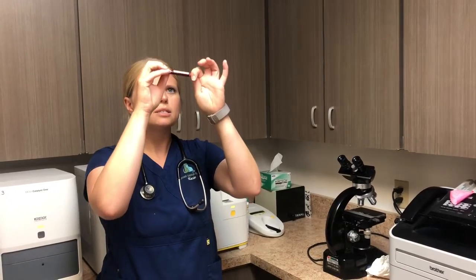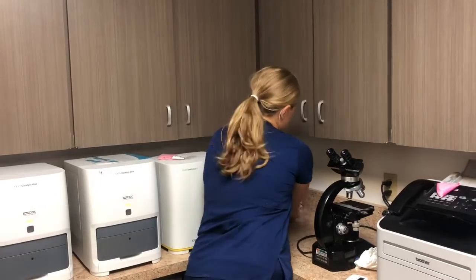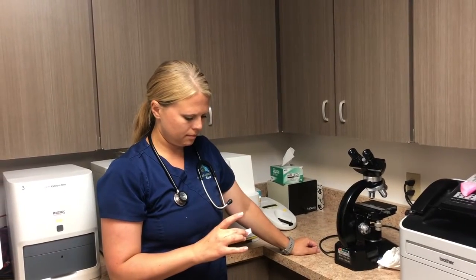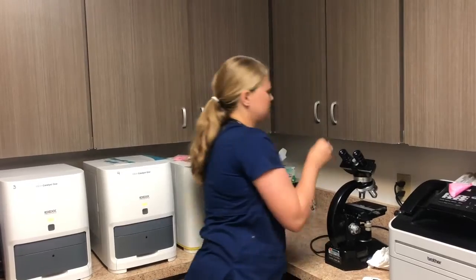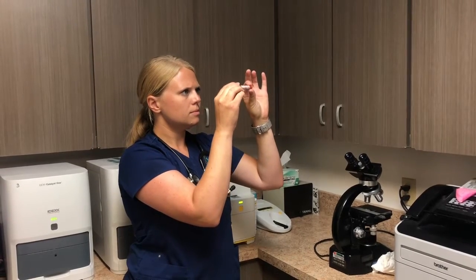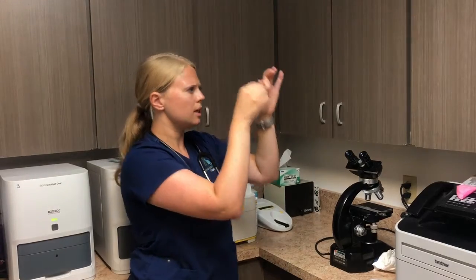Which I do not see one yet, so I'm going to put it back in there, and we're going to check about every 5 seconds. I'm going to wait 5 seconds here. Check again. And incubate again if I don't see a clot.